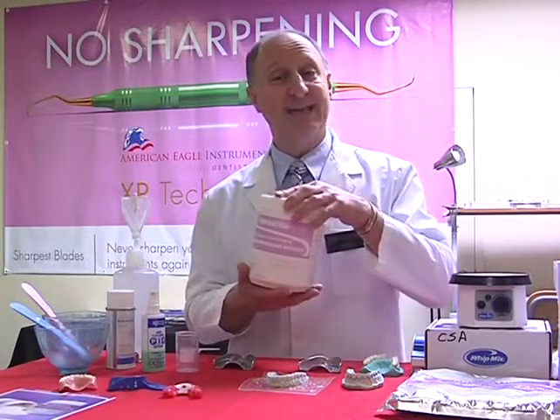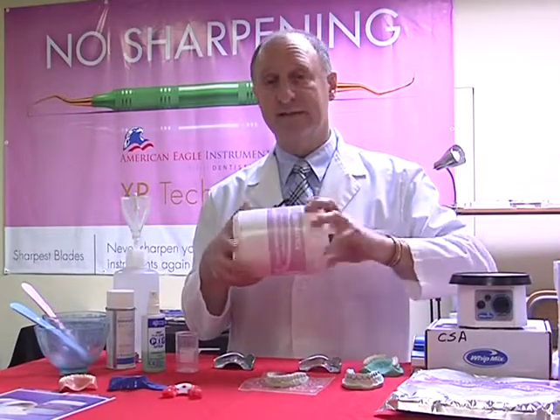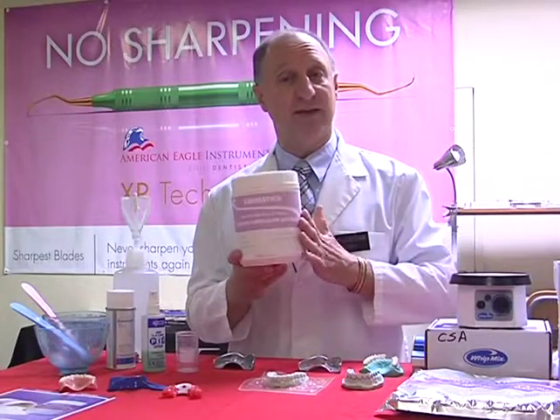So to fluff an alginate, any alginate, we put the canister onto its side and revolve the canister 3 times. Once it's gone through 3 revolutions, it's fluffed.